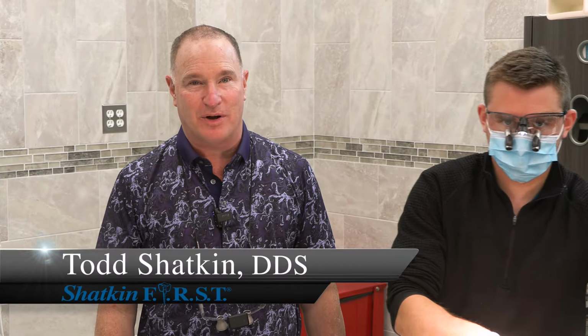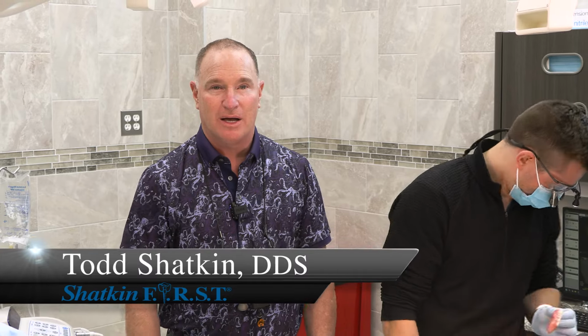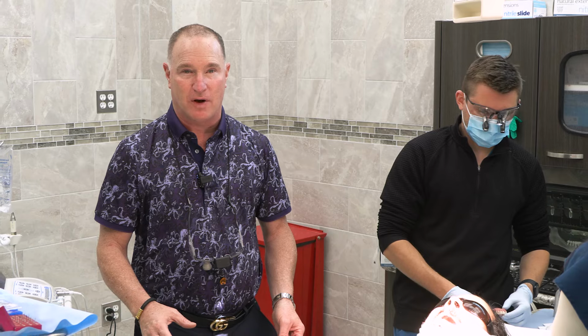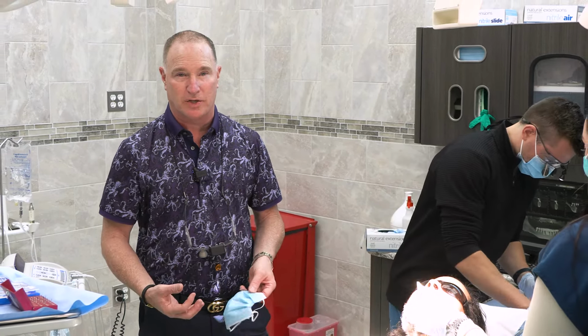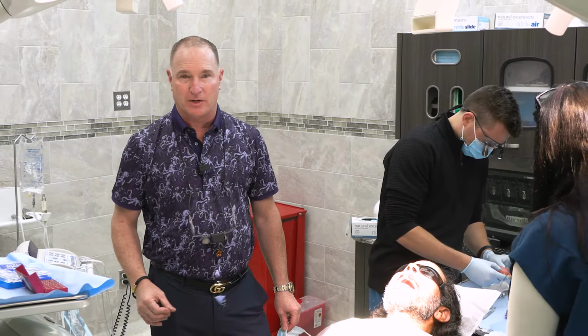Hi, I'm Dr. Todd Shatkin. Today we're going to be placing 10 implants on Robert's upper jaw. We already completed his lower with a zirconia cemented roundhouse. On the top, we're going to be doing a Zantex Allure restoration to give him a little bit of lip fullness and to get rid of his upper denture.